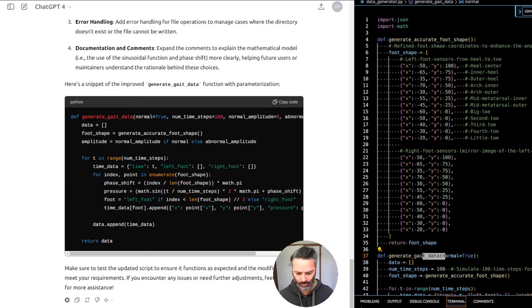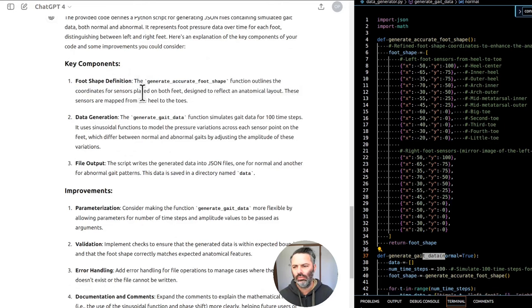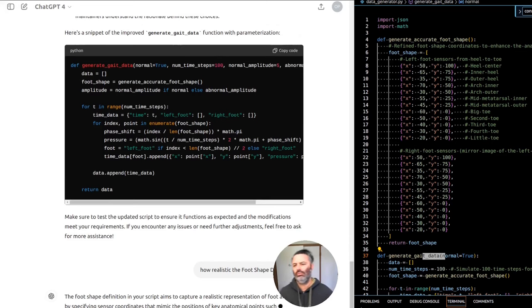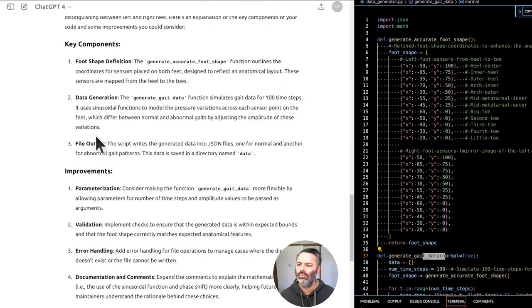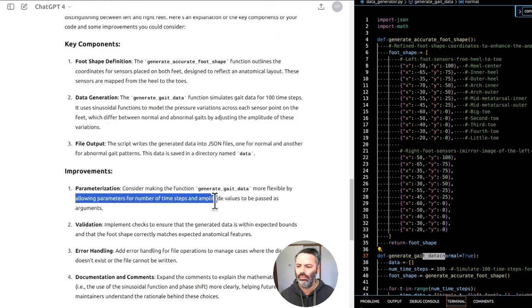Key components. 1. Foot shape definition. The generate accurate foot shape function outlines the coordinates for sensors placed on both feet, designed to reflect an anatomical layout. These sensors are mapped from the heel to the toes. 2. Data generation. The generate gait data function simulates gait data for 100 time steps. It uses sinusoidal functions to model the pressure variations across each sensor point on the feet, which differ between normal and abnormal gaits by adjusting the amplitude of these variations. 3. File output. The script writes the generated data into JSON files, one for normal and another for abnormal gait patterns. This data is saved in a directory named data.